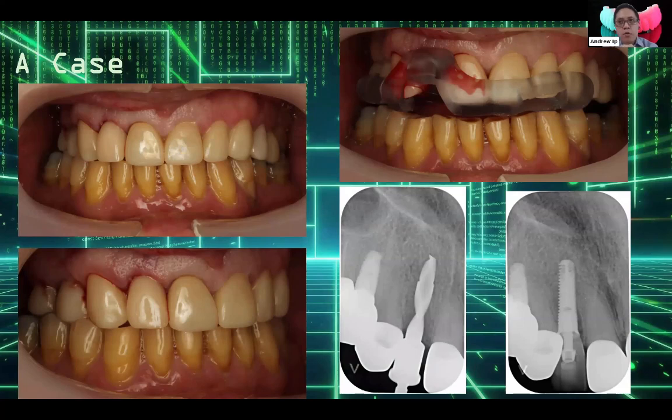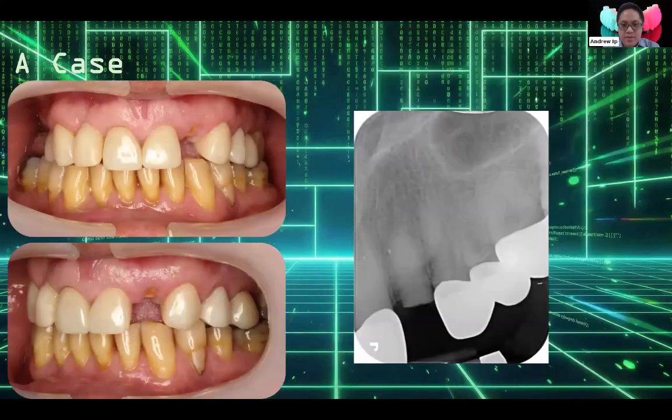But as I mentioned before, the issue with making it beforehand is that your placement of your implant has to be basically perfect. Otherwise, the corresponding provisional restoration that you've pre-made may not fit, and then you may be in trouble. But in this case, it's worked out in my favor. So that went well.